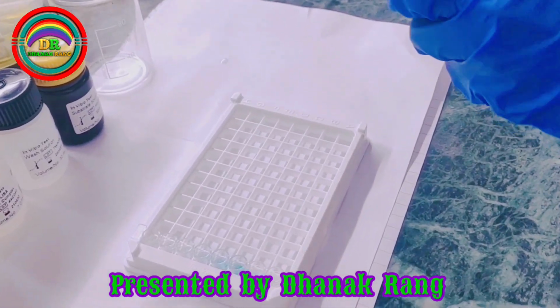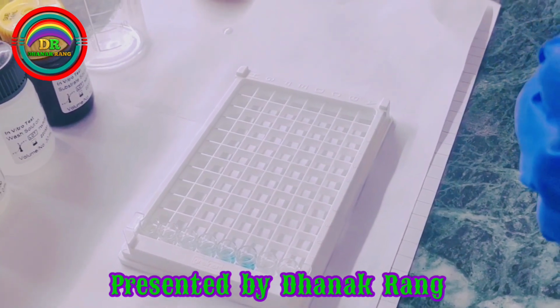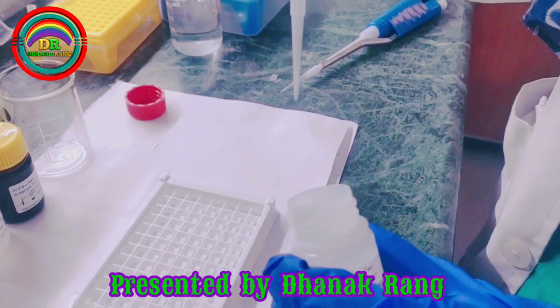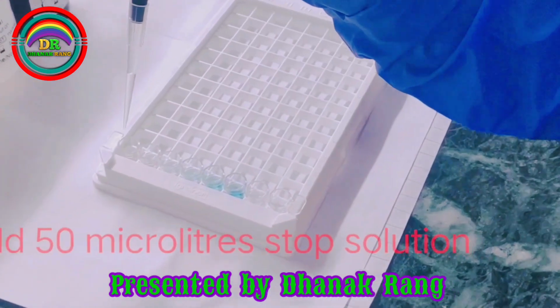So now we'll add the stop solution to stop the reaction, and then we'll take the reading. So we'll take 50 microliters of the stop solution in each well.